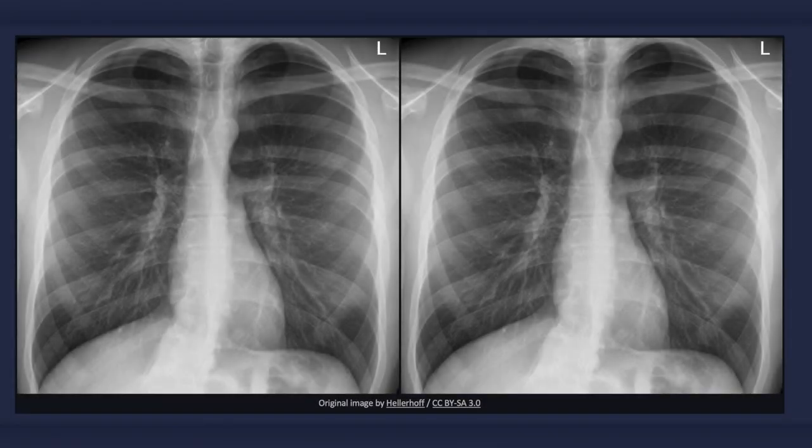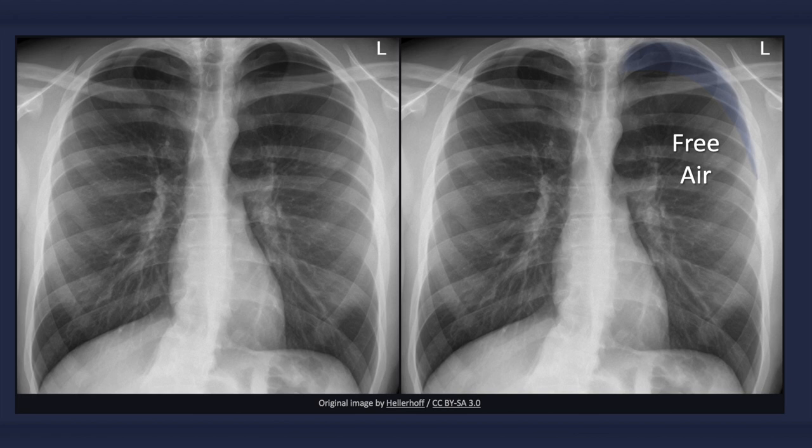A pneumothorax refers to the presence of gas or air in the pleural space. It is considered a simple pneumothorax when there isn't any mediastinal shift to the contralateral side and the patient is stable. In regards to detecting a pneumothorax, the most important aspect is simply looking for it. The X-ray may be almost entirely normal except for a small crescent of lucency next to the lung, which can be easy to miss.